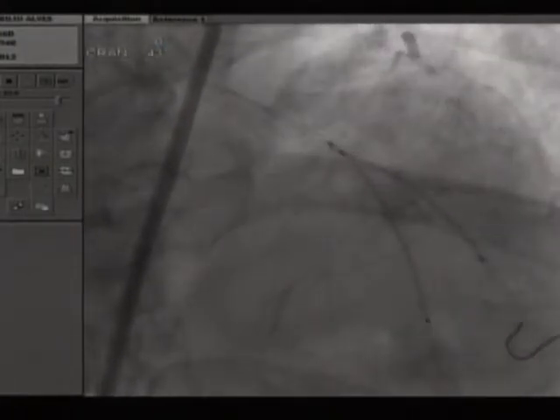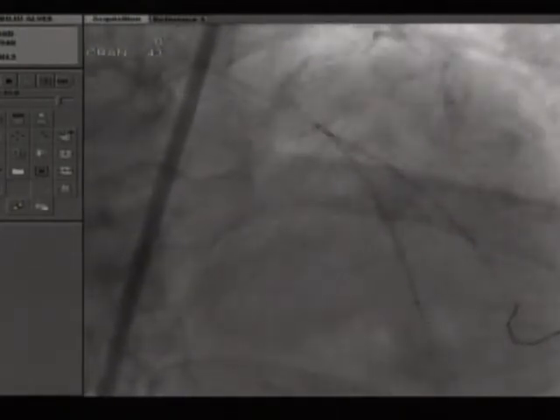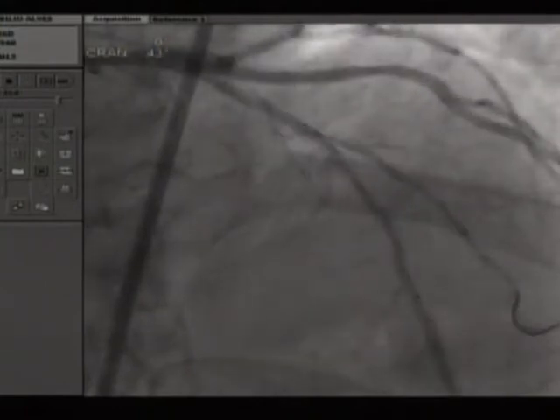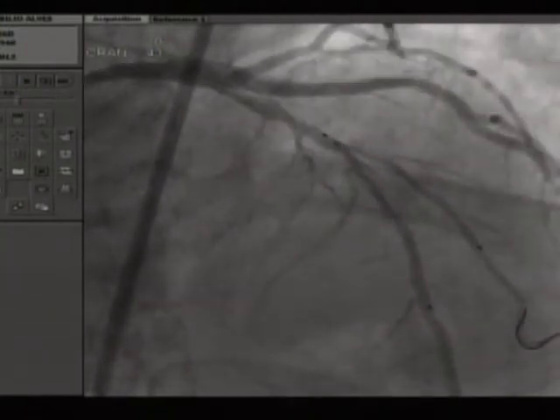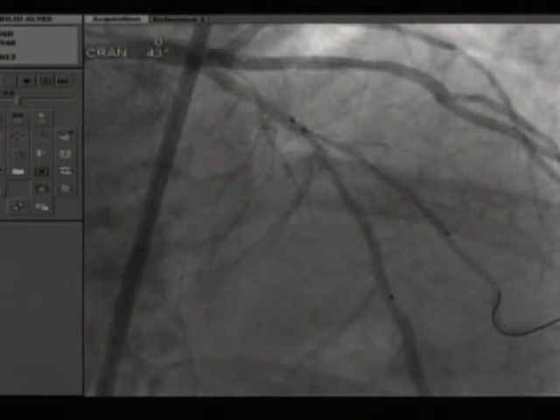Thank you, Eberhard. If you freeze the image, you see the diagonal, you have just a little metal in the LAD, just to be sure. The stent has covered the ostium of the diagonal. What do you think, Alex, in the panel? I think it's the position of the stent in the diagonal. I think it looks good.